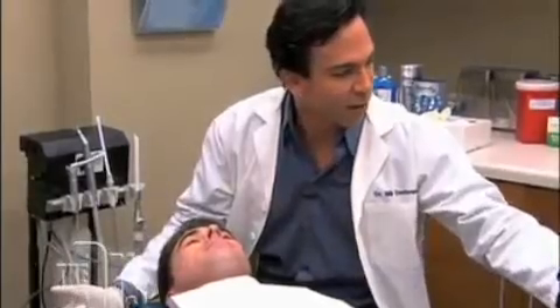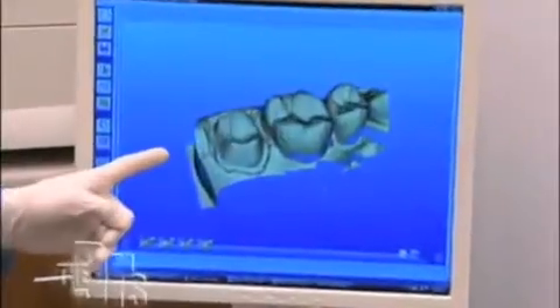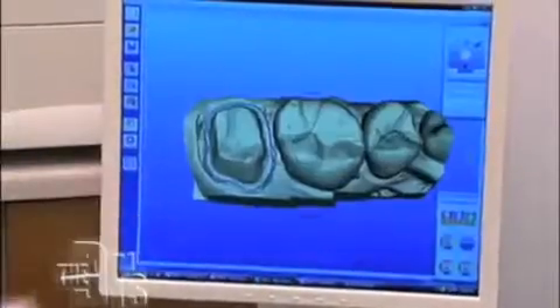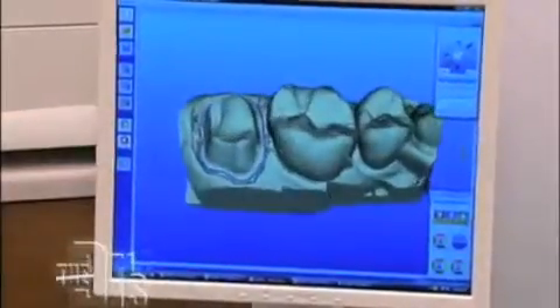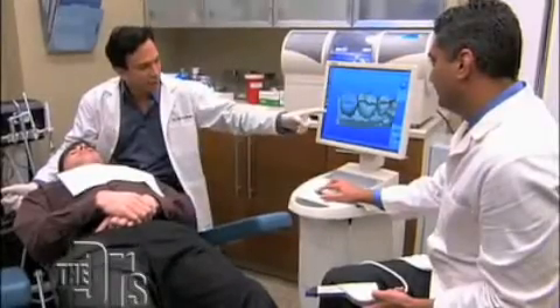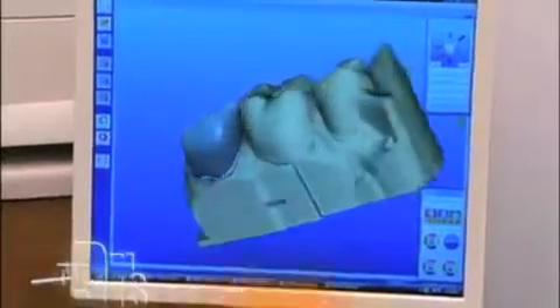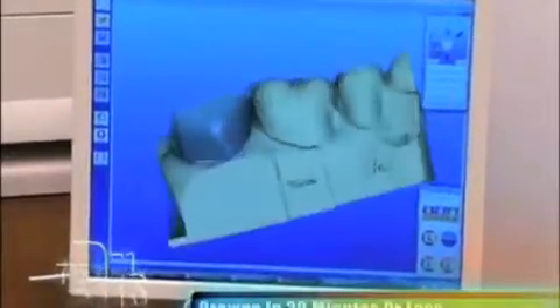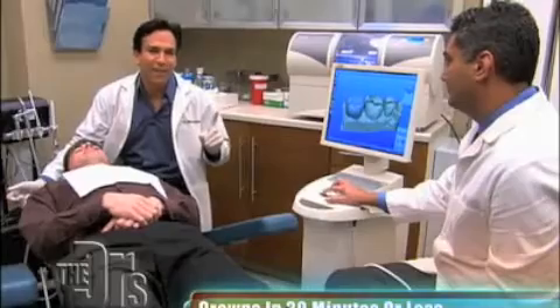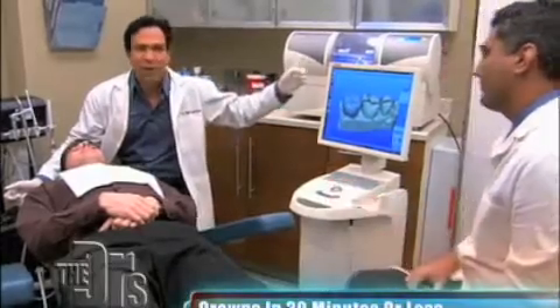This is a digital impression, and you can see that we can move this around. The impression is going to have a margin — let's show the margin. This is where the crown fits. What will happen at the end is the crown is actually going to go on the tooth. All I have to do is push this one button and this machine is going to mill the crown.